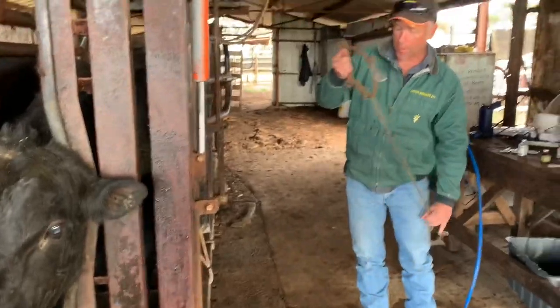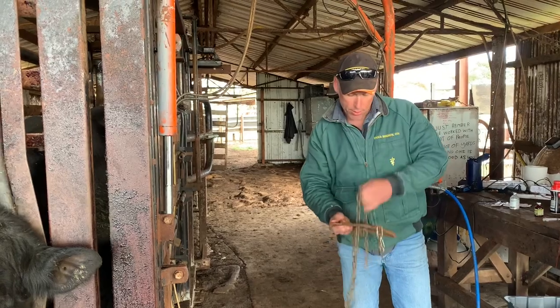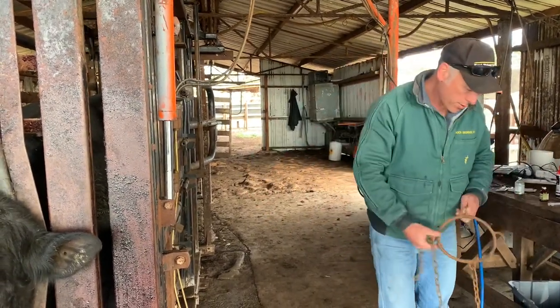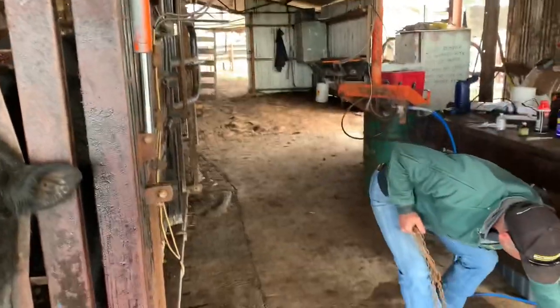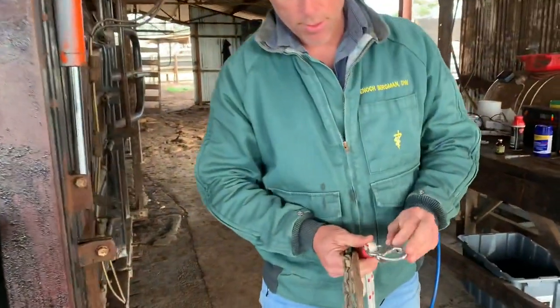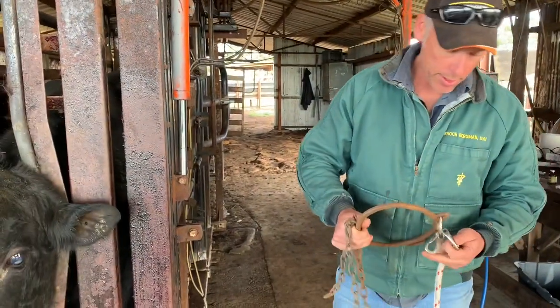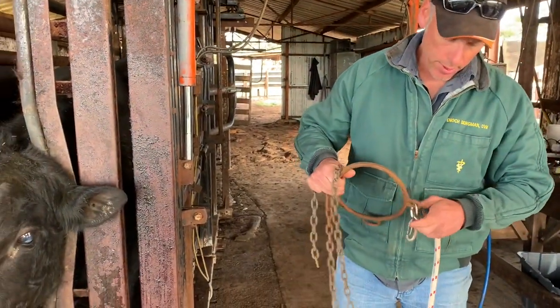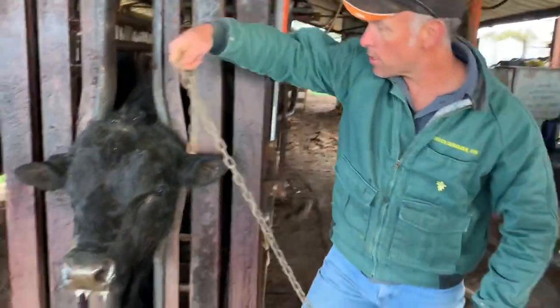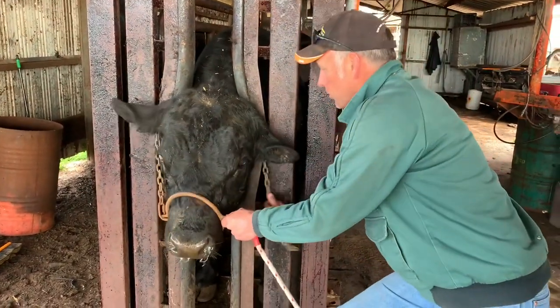So veterinary tools — this is called the metal halter. And Swanee got onto it after a guy by the name of Kabassi was using it for introducing show steers to the ring. Pretty simple concept. The other thing we've got is a rope that's got these cleats, which are a sailing cleat for quick release if you need to release it. Sometimes they'll throw it around — if you wear this halter in your face, it hurts.